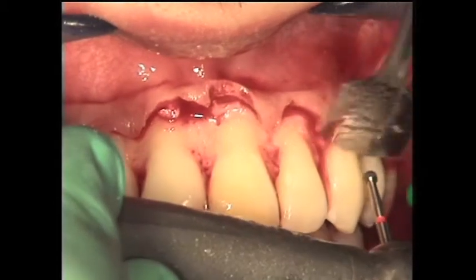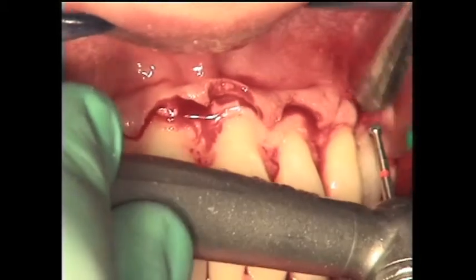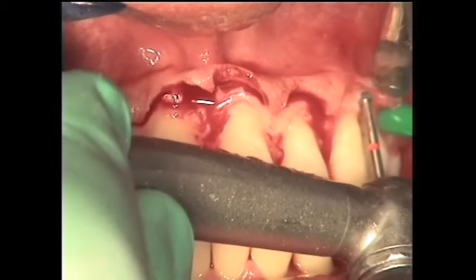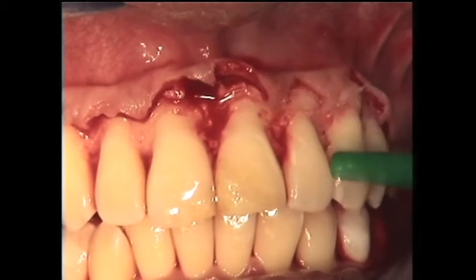Especially on this upper left canine, you can see the bulkiness of the bone that needs to be thinned in order to be able to reposition the flap in the best possible and passive way. You can see that the burr actually flattens and cuts through the bone horizontally first.